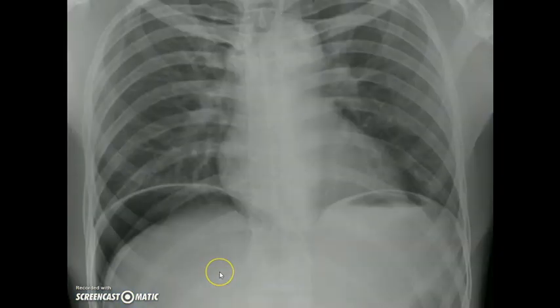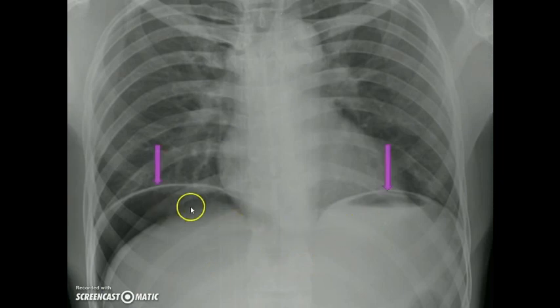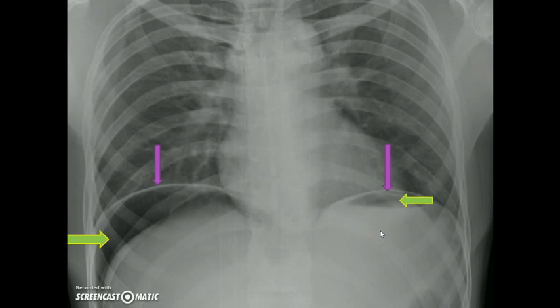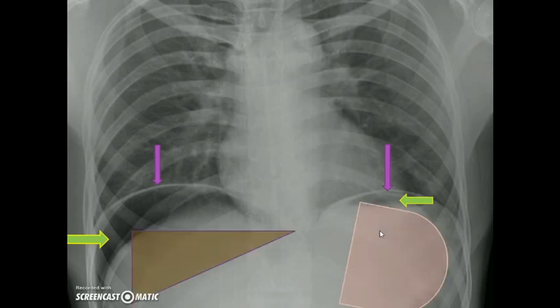This is a case of air under diaphragm. In an X-ray, air is seen as black. We can see both domes of the diaphragm — the right dome and the left dome. We see air on both sides. On the right side we have the liver; on the left side we have the stomach. The problem on the left side is that we have both the fundic air shadow and air under diaphragm, causing confusion about whether it is fundic air or pneumoperitoneum.